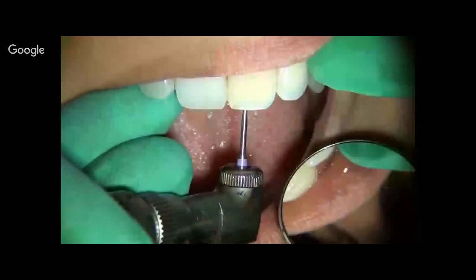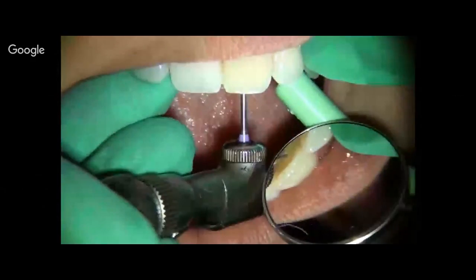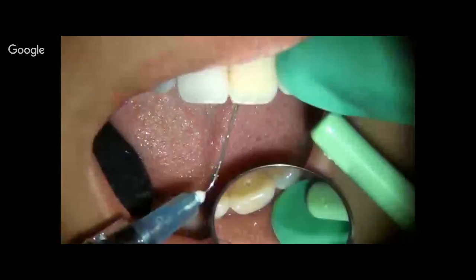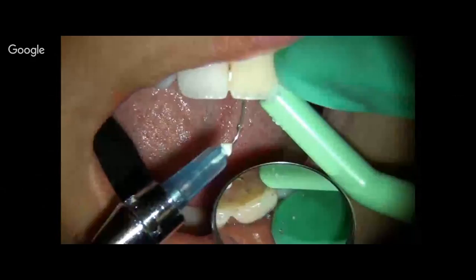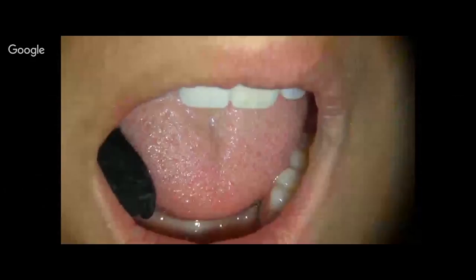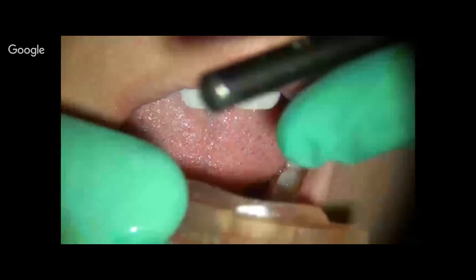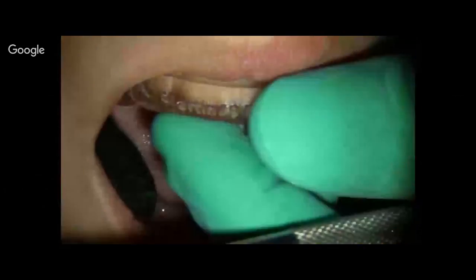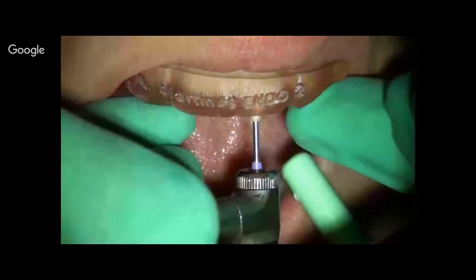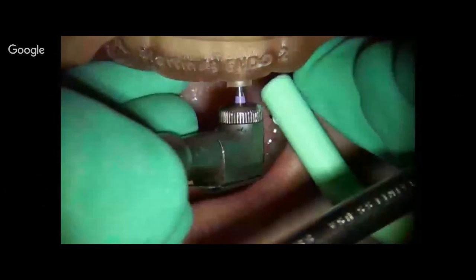The limitations of drilling through this is you have to clear your path from dentin chips. Otherwise, you can pack that dentin inside the canal and ahead of your drill bits, and you end up blocking the canals and not being able to negotiate it. So one of the steps needed, and actually very important, is you drill a little bit for a few millimeters, take it out, rinse it off, and clear the dentin chips. Go back in, drill a couple more millimeters, and then clear the chips again.